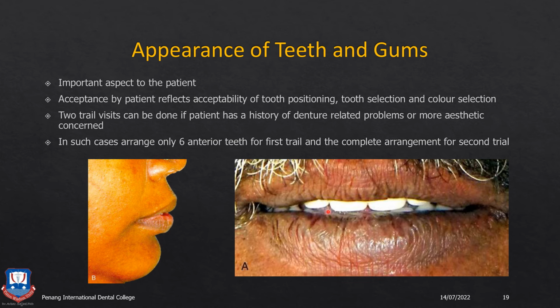Then you have to check for the incisal visibility in the case of the upper denture. In older individuals, usually there will be only about 0.5 to 1 mm of incisal display of the upper anterior teeth. In some cases, there will be no display of the upper anterior teeth. Instead, you will have a display of 1 to 2 mm of the lower anterior teeth. This is because of the loss of support of the musculature and the sagging of the facial muscles and the fascia of the face. Whereas in younger patients, say patients in their 40s who come seeking denture treatment, you should have at least 3 to 4 mm of incisal visibility.